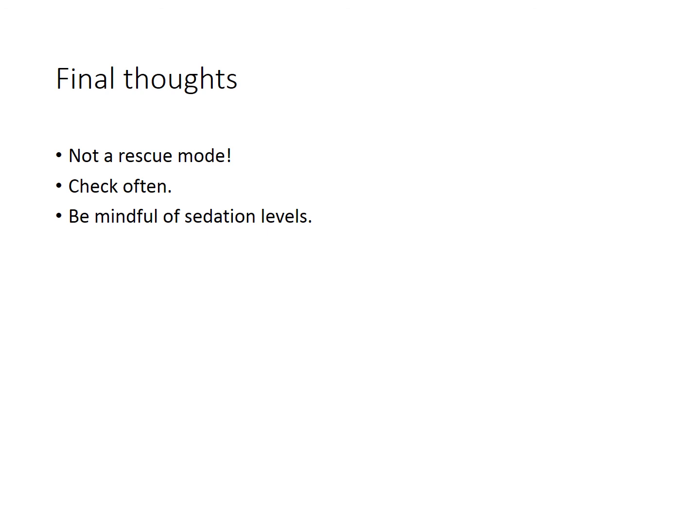And while you're talking with the nurse, it's also important to be very mindful of your sedation levels as well as the use of paralytics. A very important part of APRV is the spontaneous breathing aspect. We do want patients to breathe spontaneously for a number of reasons, and we want to make sure we're not getting too overzealous with sedation or giving paralytics willy-nilly. Make sure to work with your team, your nurse, and your physicians, addressing any of these issues that might come up.